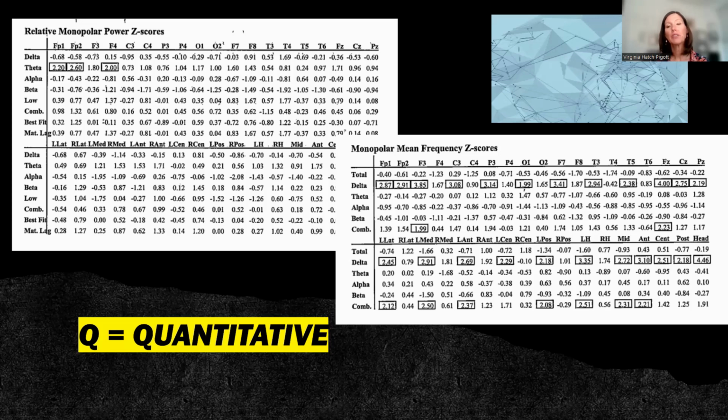But I bring that up just to highlight the fact that we're treating the patient, not the numbers. And an intake, which you'll learn more about later in the series, is very important to read what these numbers may mean, especially for the individual.